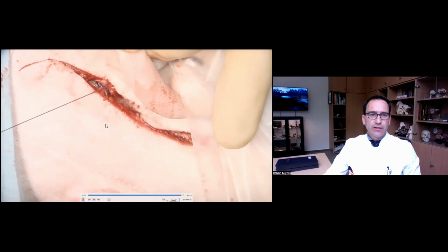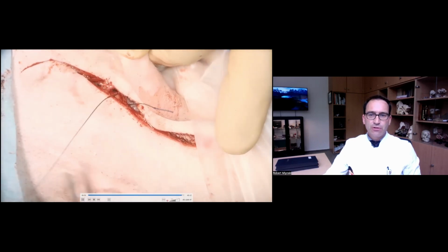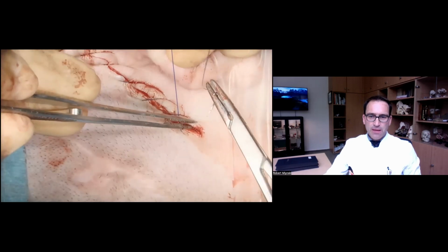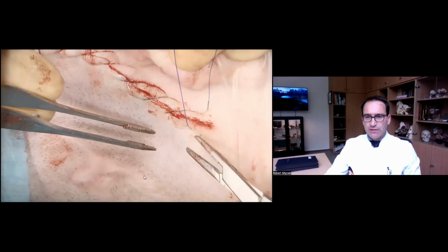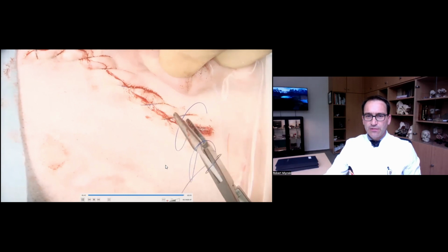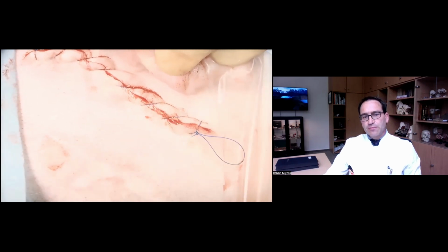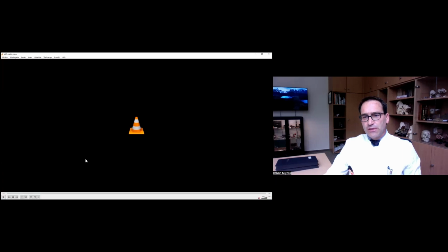And here you can see again the S-shaped retroauricular incision, which is at a far distance from the previous incision line and from the coil. The final suture is with non-resorbable monofilament Resolon 4-0. Okay, that's it. So we get back to the presentation.